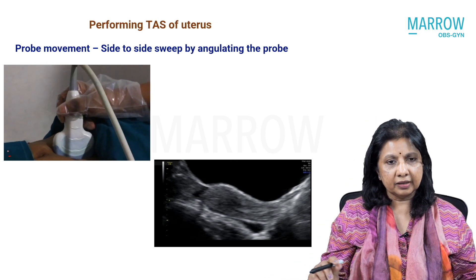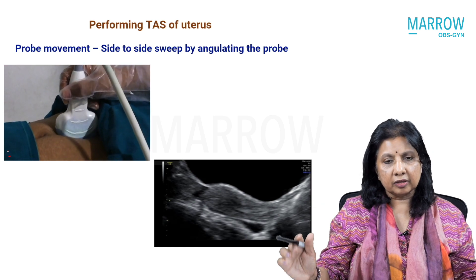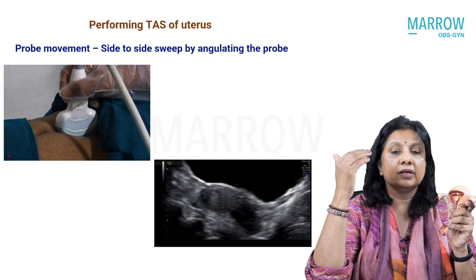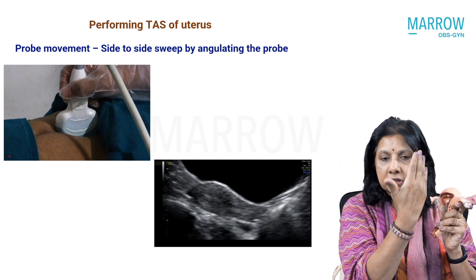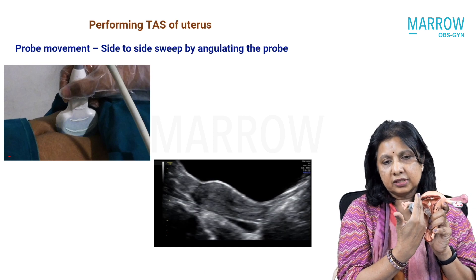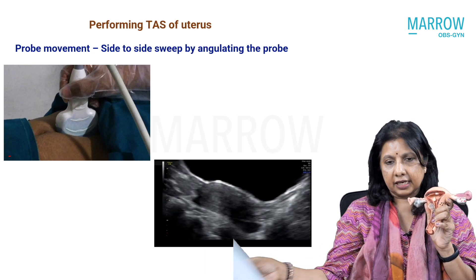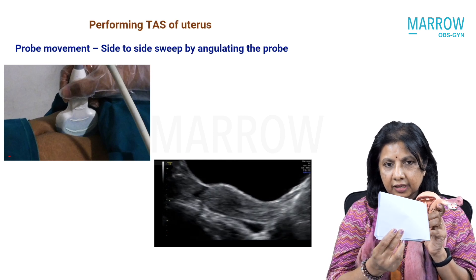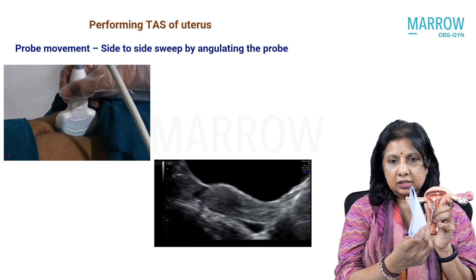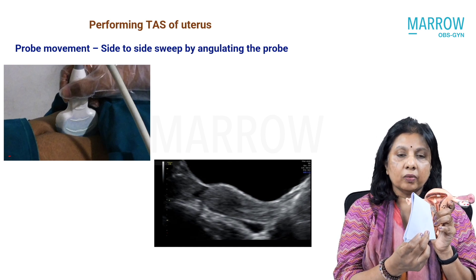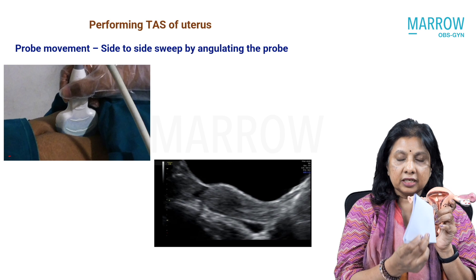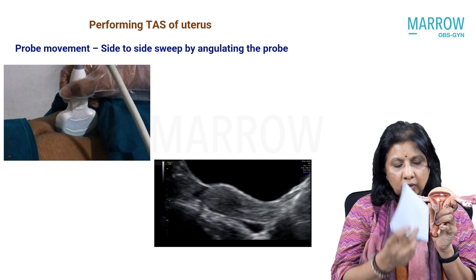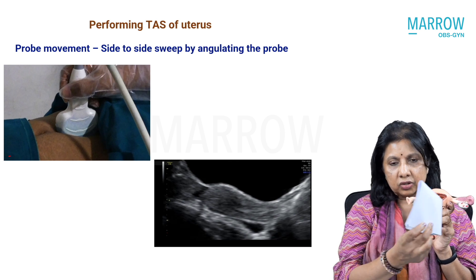The corresponding movements are happening in the bottom right. How do I know it's the right movement? Because I am sweeping — going to the margin of the uterus, losing the margin on this side, coming to the main body of the uterus, and going to the other margin. So this is called a side-to-side sweep, wherein all along I'm getting sagittal planes, which show me the anterior-posterior planes from one margin of the uterus to the other.